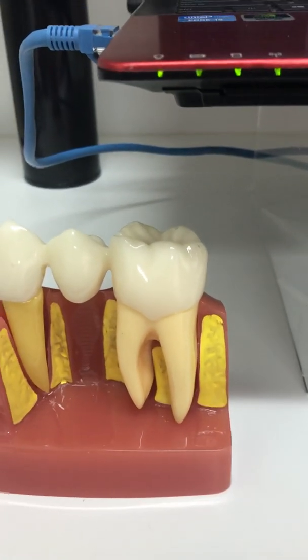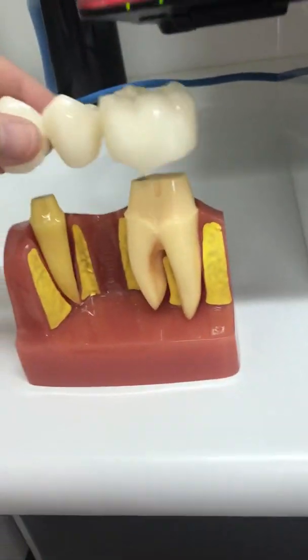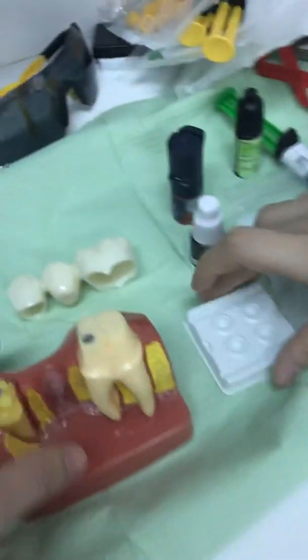So let's talk about the most commonly used crown, which with Dr. Chang will be the zirconia crown. Let's talk about the zirconia crown. You would have a piece of crown that looks like this, without the metal bits obviously.